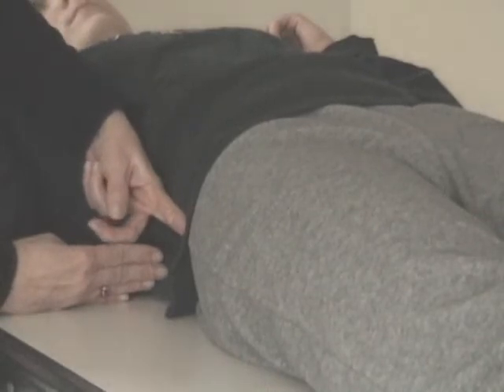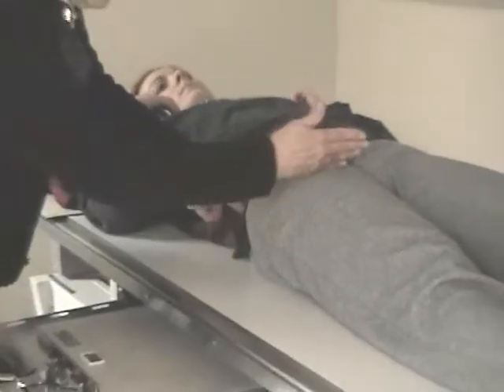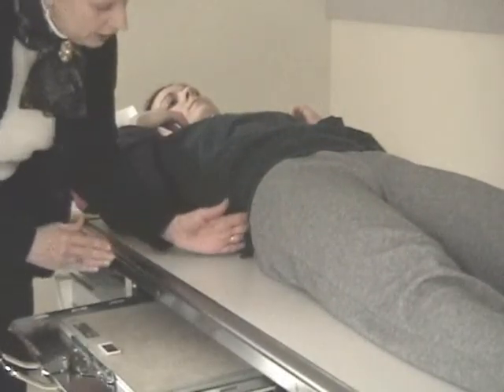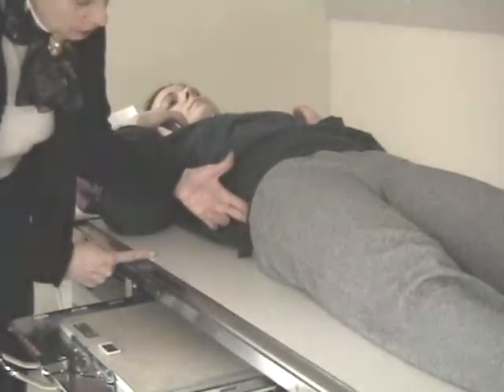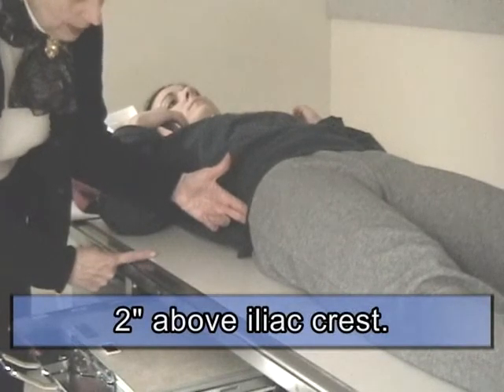And now I think you can see that the crosshair is in between my two fingers. And then let's look here. Here's the iliac crest, there's the film's edge. Film's edge is 2 inches above. If I was unable to feel for the trochanters, or if I was unable to see the pubic bone, just go with the film's edge being 2 inches above her iliac crest. Okay?